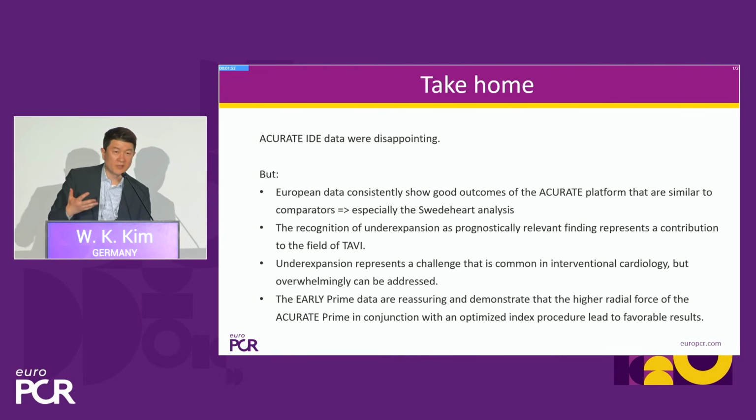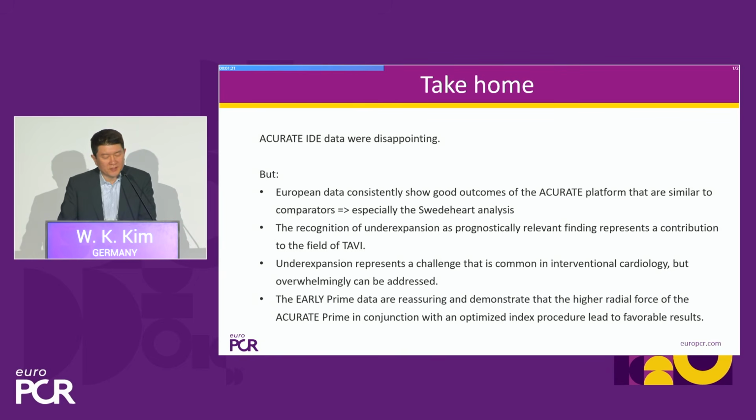We have seen a deep-dive discussion of what happened in the IDE from the European perspective. We have seen an excellent case presentation of how to do an optimized index procedure. And Fausto, a very sophisticated illustration of taking into consideration lifetime management, coronary access, and redo TAVI. And Andreas, you showed compelling outcomes with the new Prime platform. This is my personal take-home message: IDE data were disappointing, period.